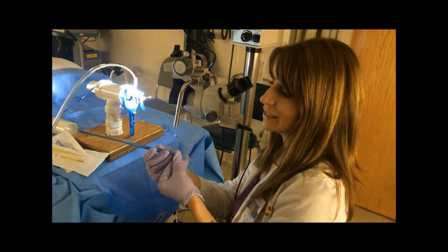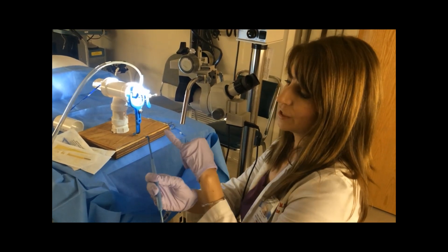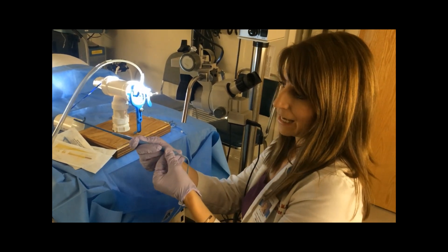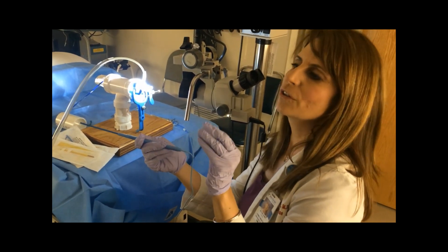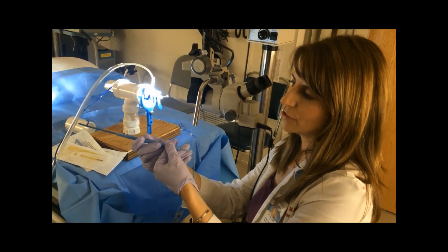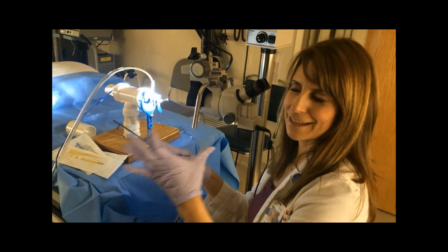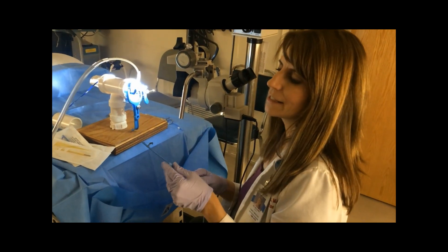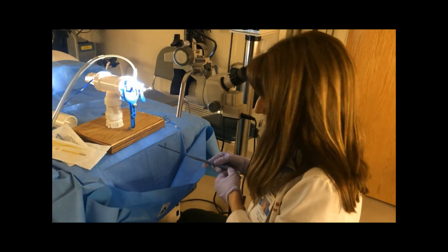You want to go at a nice steady speed and rotate it counter-clockwise. The reason you can remember it's counter-clockwise is there's a hook on it that goes that way. I decide where I'm going to make my nick based on where the most problem areas are on the cervix. If the cervical lesion is at 3 o'clock, I'm going to start my LEEP at 4 o'clock and rotate that way. We talk about the cervix like the face of a clock. The speed of doing the procedure needs to be nice and steady.